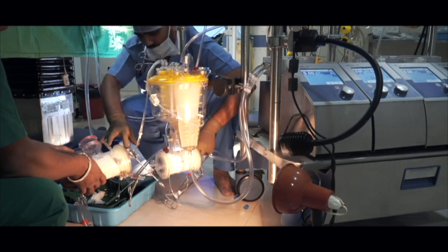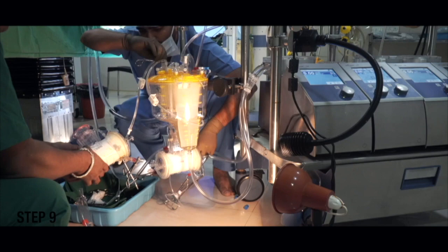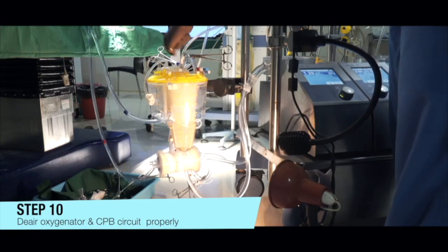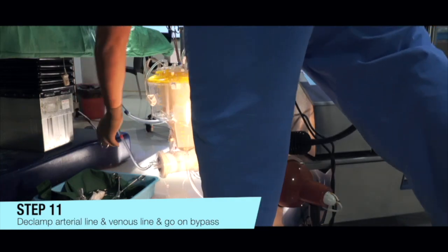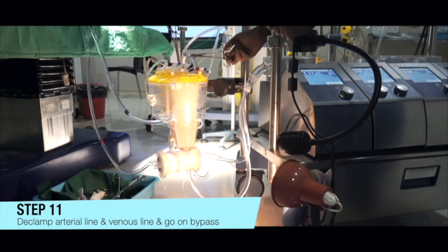And disconnect the oxygenator and keep it on the side to check the failure region. In step 10, de-air the oxygenator and the entire circuit of tubings. Now declamp the arterial line and venous line and go on bypass.